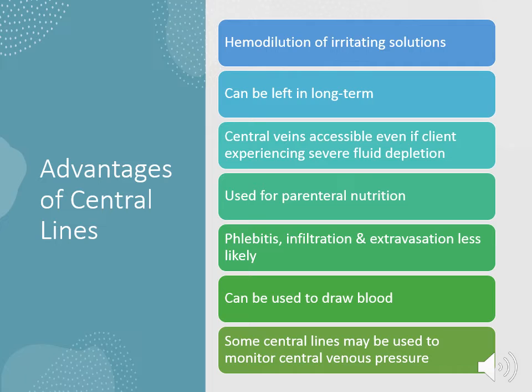I want you to review the advantages of having a central line that are listed here. Some of the things that we've already come across is that central lines can be left in long term. Central veins are accessible even if the client is experiencing severe fluid depletion. So if a patient is severely dehydrated, it's easier to access their central veins than it is to access a peripheral vein. Phlebitis and infiltration are less likely.